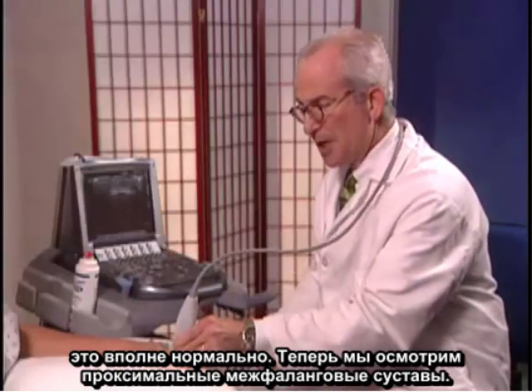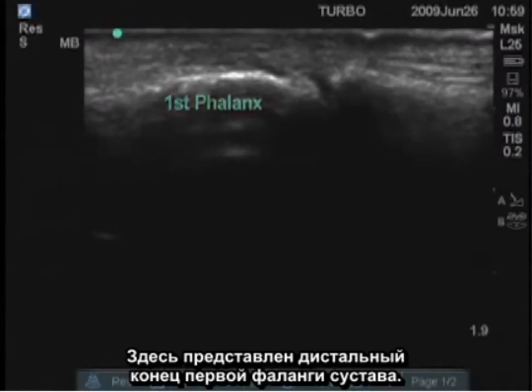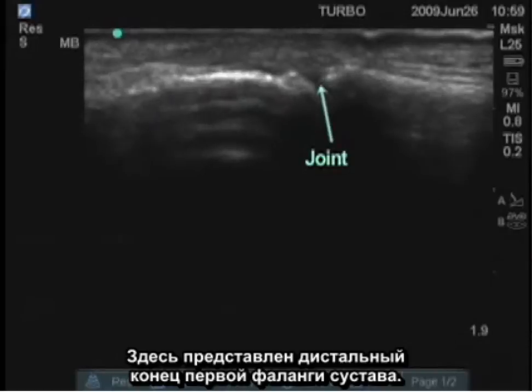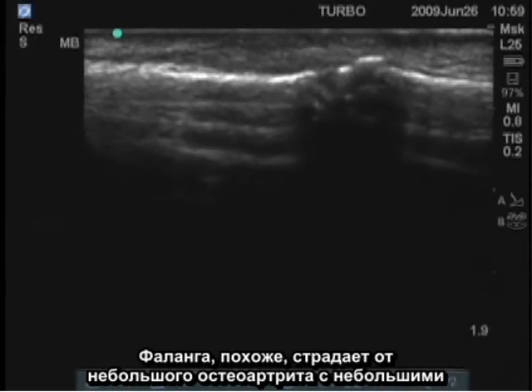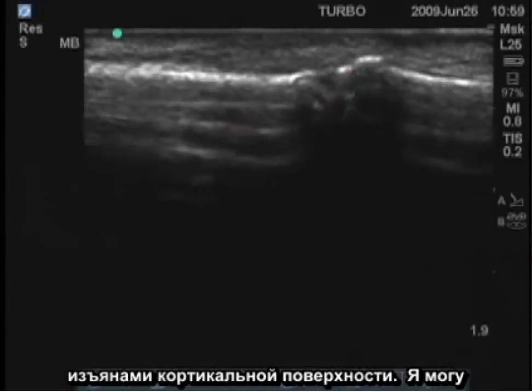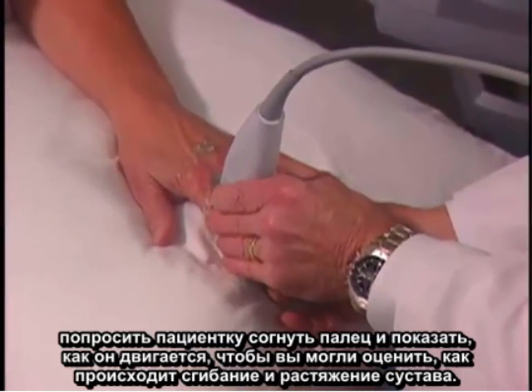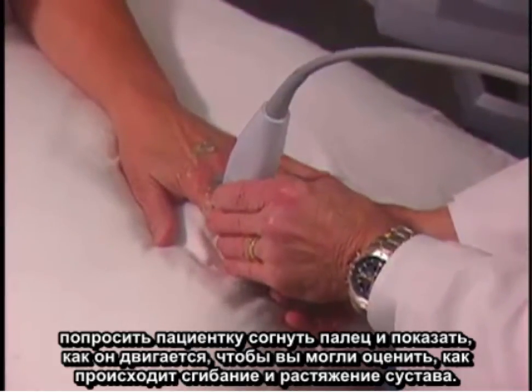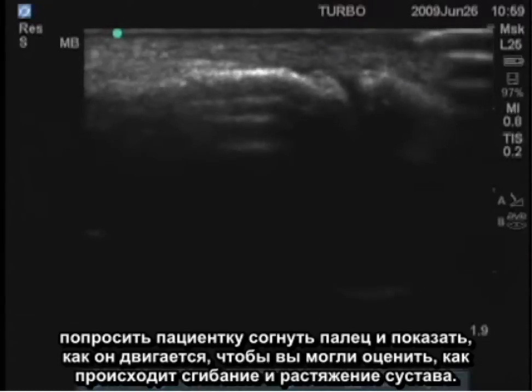We'll look at the PIP. This is the distal end of the first phalanx — the joint is this space here. She happens to have a small amount of osteoarthritis here with some irregularity of this cortical surface. I can show you where this is actually moving, and you can see that joint flexing and extending.